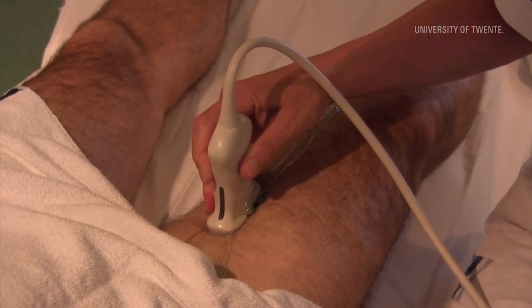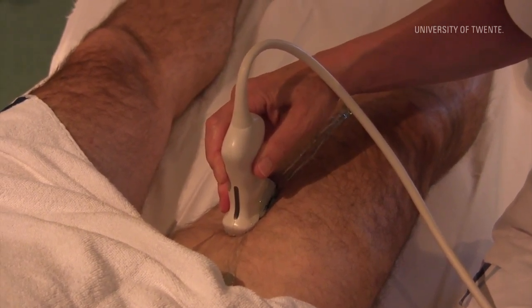In the ultrasound examination we used the duplex technique. This gave us information about both the anatomy and the physiology of the lower limb arteries. We would like you to think about how to interpret this information correctly.